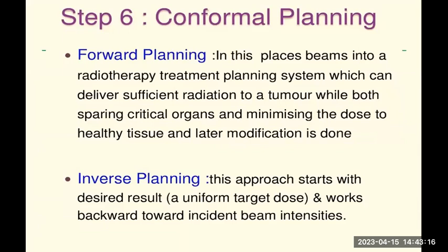A uniform target dose is planned, and we plan in a reverse way to do the beam intensity modulation. To understand that, imagine a tumor size of 3 mm.